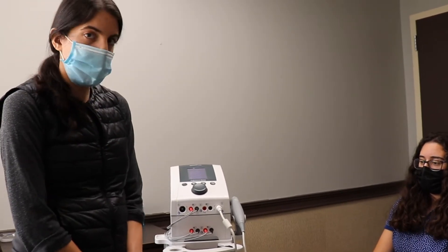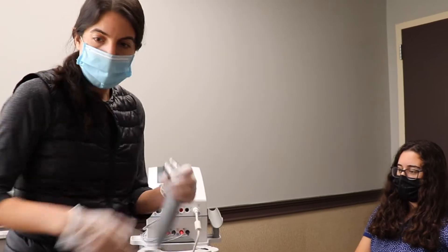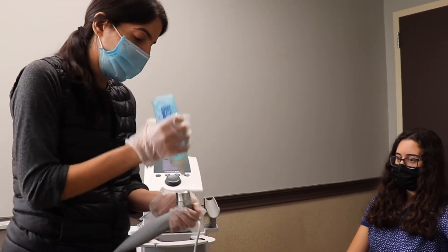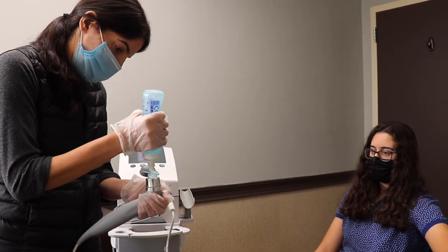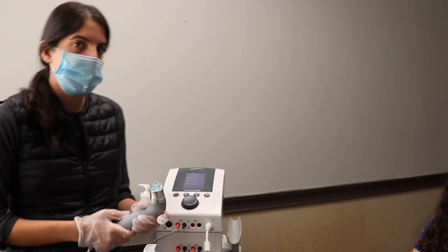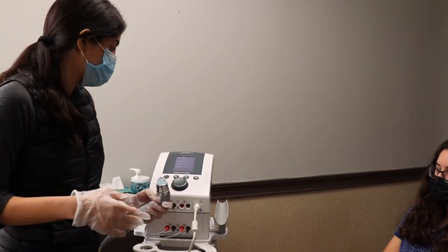So today we're going to do the ultrasound of her elbow over here. What you'll do is take the ultrasound head and use ultrasound conductor gel. If you don't use this it could burn the patient, so we put a bunch of that on the head. There are two different types of ultrasound you could do — there's pulsed and not pulsed — and depending on what we feel and see through our evaluation, we'll decide which one to go with.